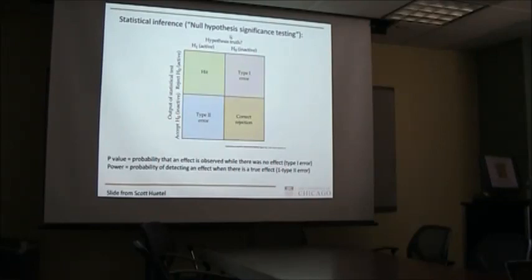as the null hypothesis significance testing, right? And it's probably familiar to most of you. The idea is that say you find some activation in some region, you want to statistically test whether there was truly activation in that region, and if there was, that would be a hit. Whether you think you see an activation, but there's actually nothing, in which case you make a so-called type 1 error.